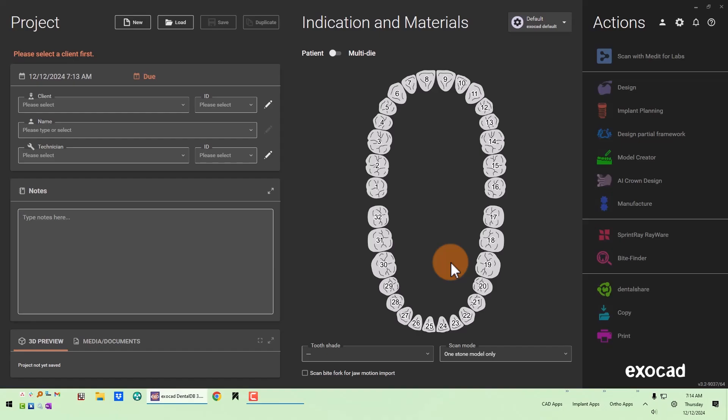That's how you get the icon enabled so you can go down the workflow for AI crown design. The next part I'm going to show you is what the AI crown design workflow actually looks like.